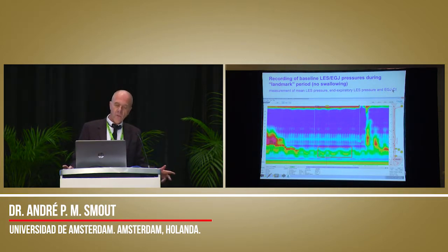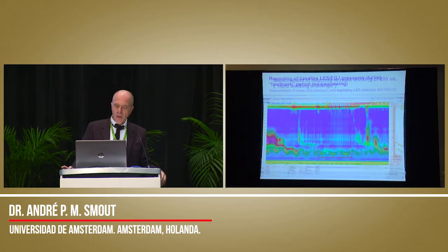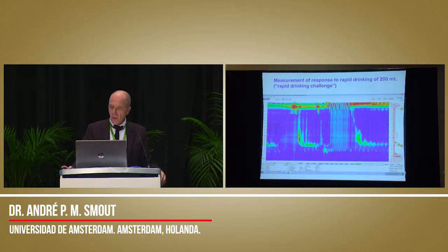And you can also measure a new thing that is the contractile integral of the esophagogastric junction. These are still quite experimental, and we don't use them in any clinical care, but they are there in the system for one day a new PhD fellow will bake a cake out of this.